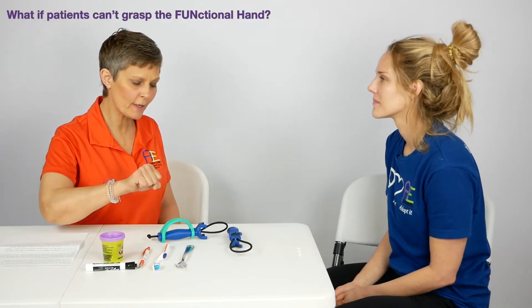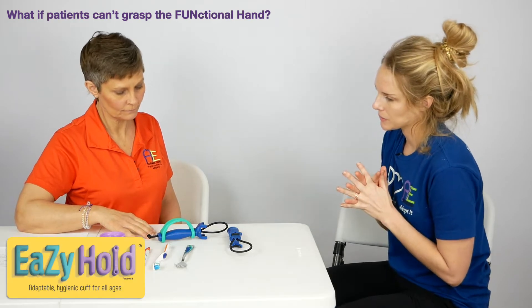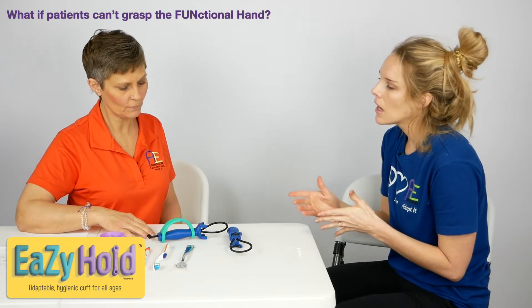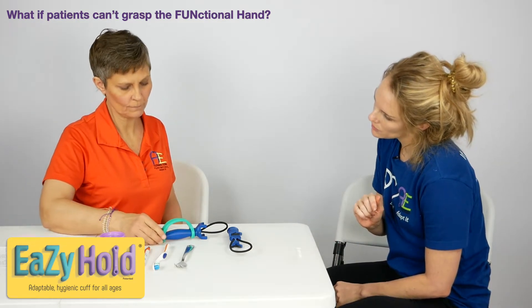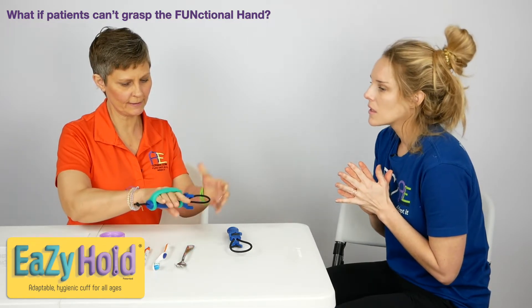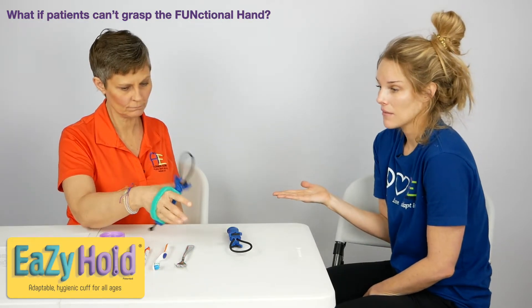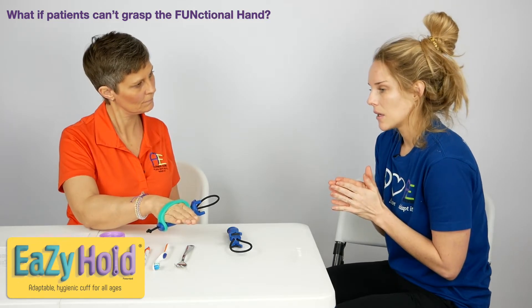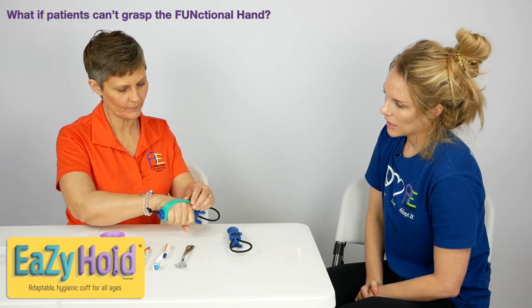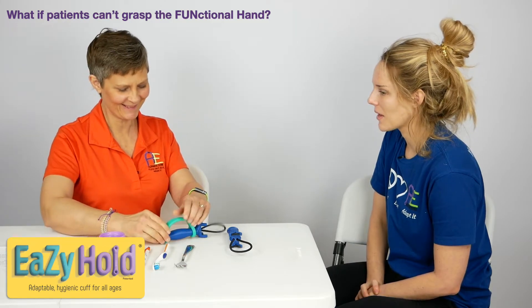What if a patient actually could not grasp or grip the Functional Hand? A great addition to that is the Easy Hold. You would probably have to have somebody add that onto you before using, but there are lots of different sizes depending on your grip and hand size. It goes on like this and over your knuckles to help hold it. Depending on the size of the Easy Hold, you don't have to have grip at all — you can really just slide your hand in there, and voila, right into all the functional tasks.